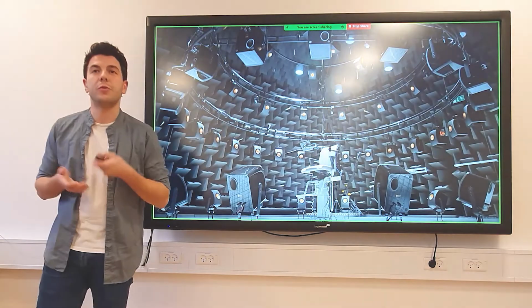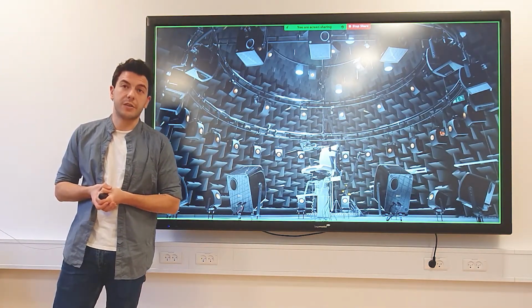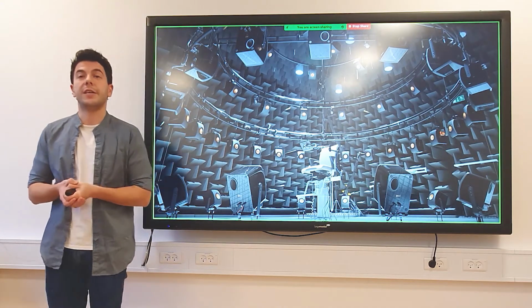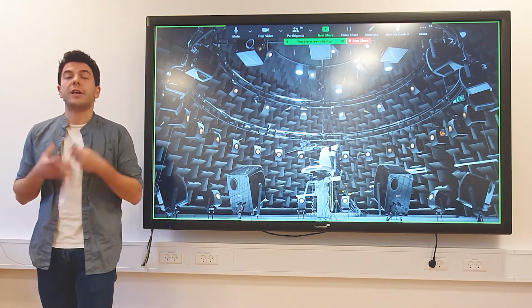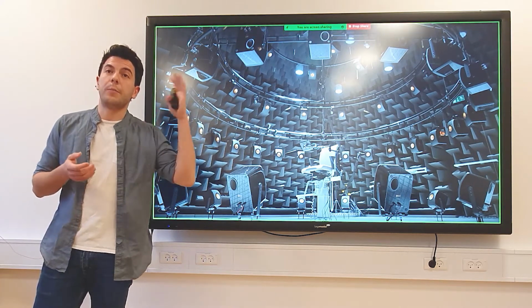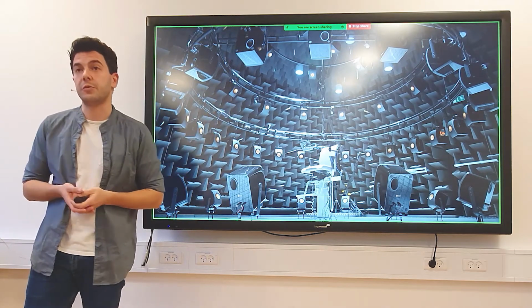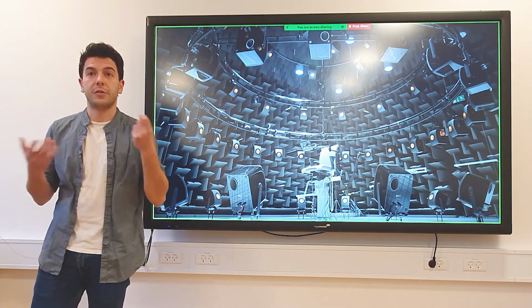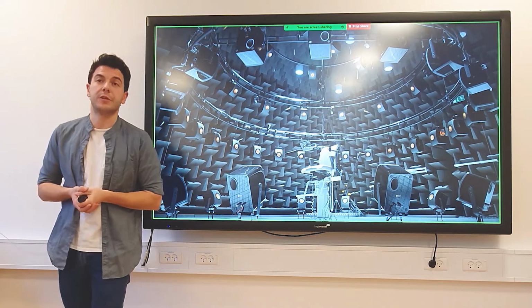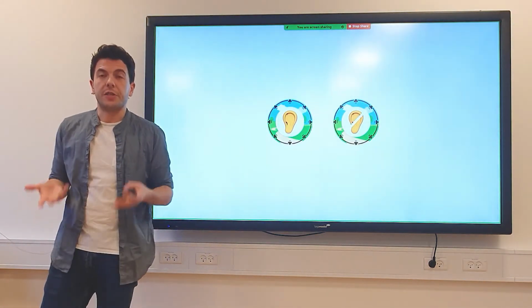And to do that, we used the Audiovisual Immersion Lab here at DTU, which is a 64-channel spherical loudspeaker array in an anechoic chamber. We used ambisonic encoding and decoding of the 4th order to map the 32-channel microphone array input signal to the 64-channel output signal to be played back to the participant. And that's how we were able to construct these listening tasks.